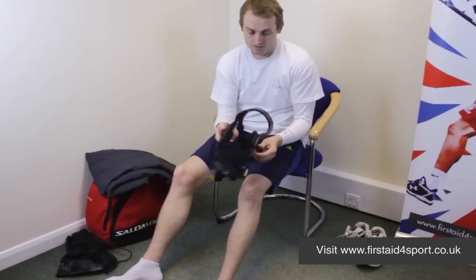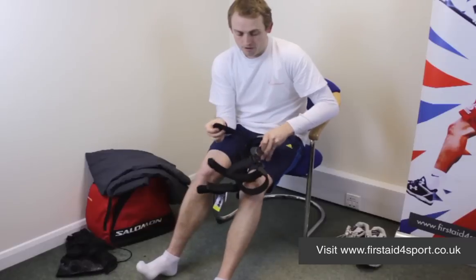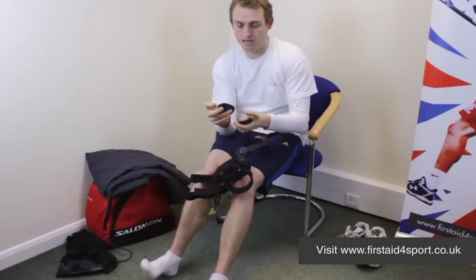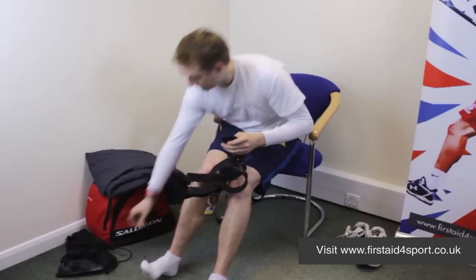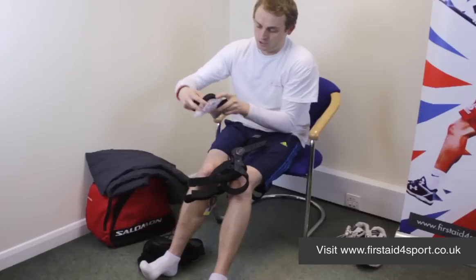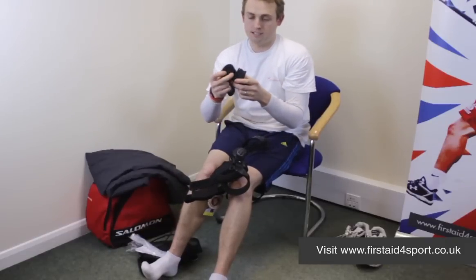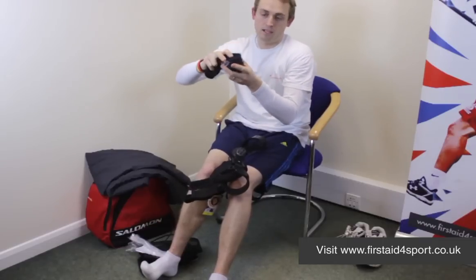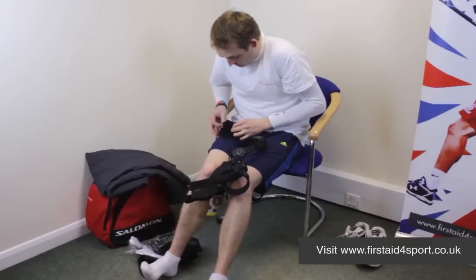On either side of the brace, on the hinges, are removable pads called condyle pads. They're just a piece of rubber with a Velcro sticker on the back and a little cover that goes over the top for comfort. These can be adjusted. In your bag when you buy the brace, you'll get a pack of condyle pads and extra covers, all different thicknesses from very thin to very thick. You can put them together to make different thicknesses to make the brace fit as comfortably as possible.